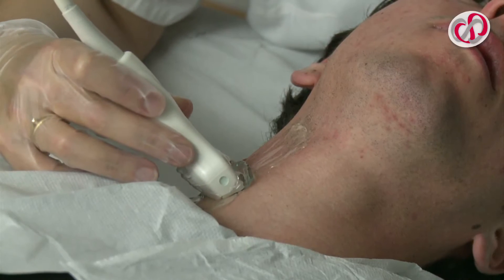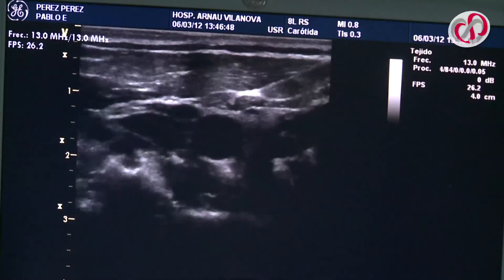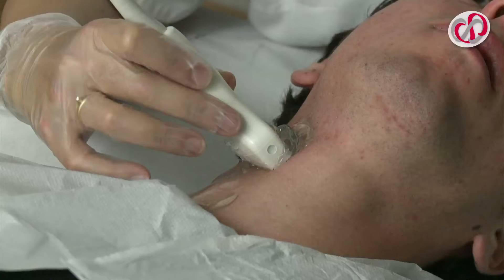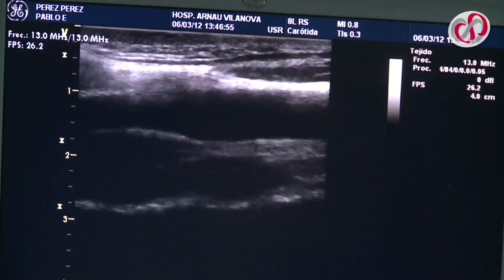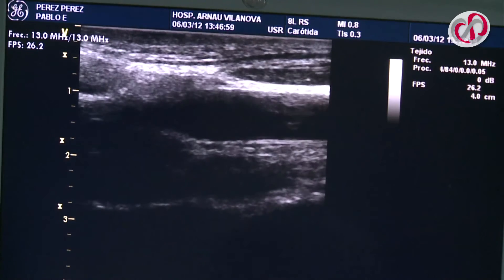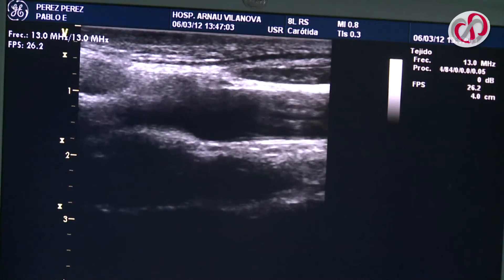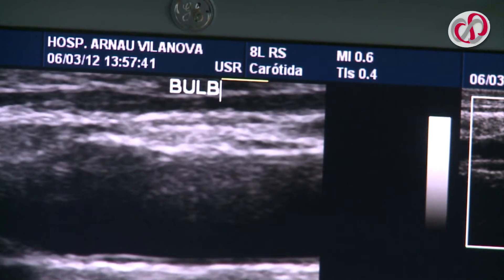In order to obtain a good image of the intima media thickness of the bulb, we make a cross-sectional exploration of the carotid as far as the bifurcation. We rotate the probe to a longitudinal position at the level of the bulb in order to obtain a good image of the common carotid, the bulb, and the internal carotid artery. The image is captured, identified with the corresponding name, and saved.